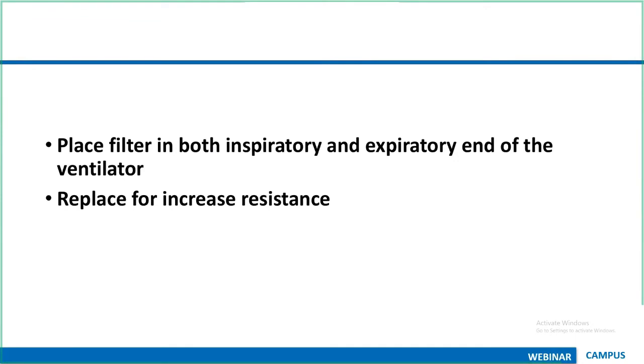So for any patient, if you see the airway pressure going high, that means you have to change the filter. In the same way, one filter at the maximum you can keep for one day, not more than that. You will have to change the filter every day. If the resistance is increasing and the pressures are going high, definitely you will have to change the filters.